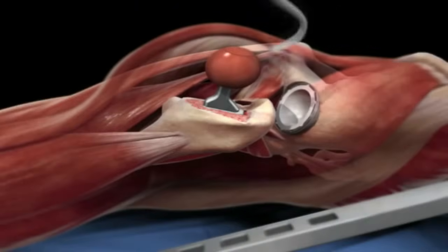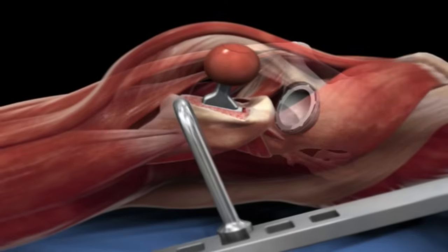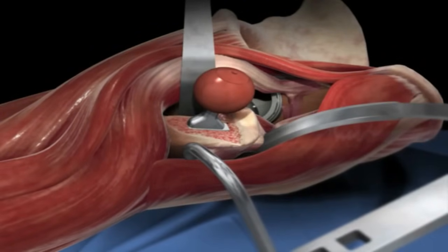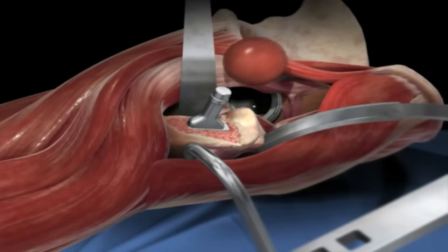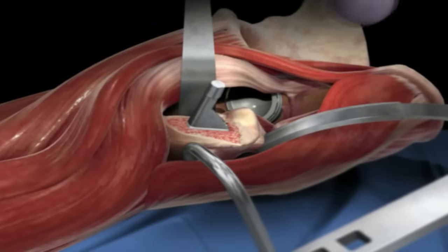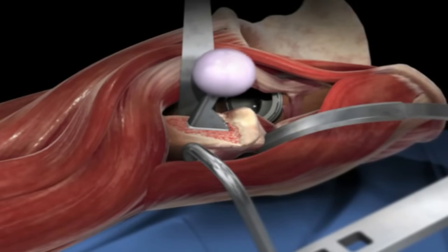If everything looks good, the femur is exposed again with the retractors. The trial parts are removed and replaced with the actual prosthetic implants. If any changes need to be made after the first trial, the surgeon can make adjustments and then implant the actual prosthesis, which includes a new ceramic femoral head.